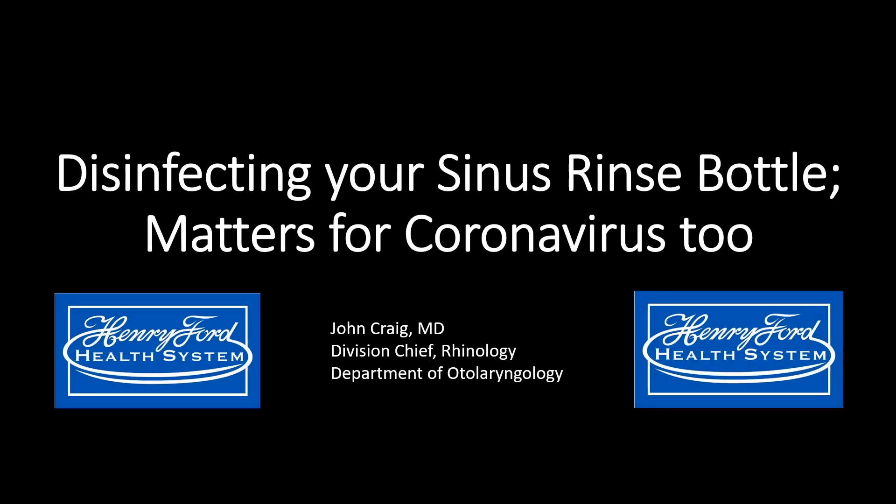This is a quick video showing some simple and effective methods for disinfecting your sinus rinse bottle. These practices are specifically pertinent to the current coronavirus pandemic, as these disinfection practices can decrease the contraction and spread of coronavirus as well.